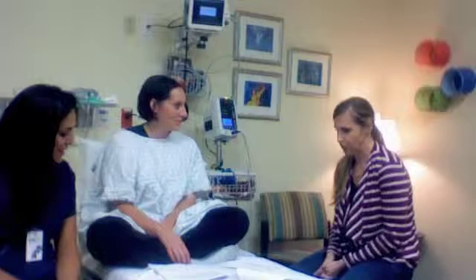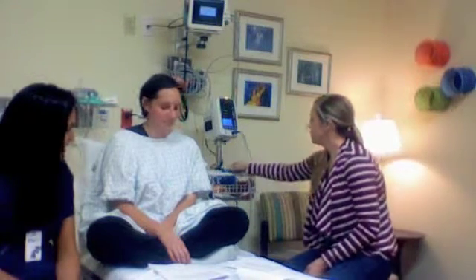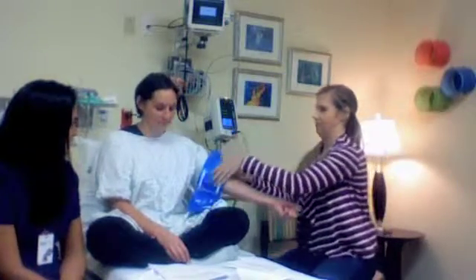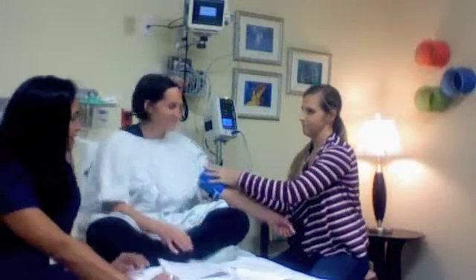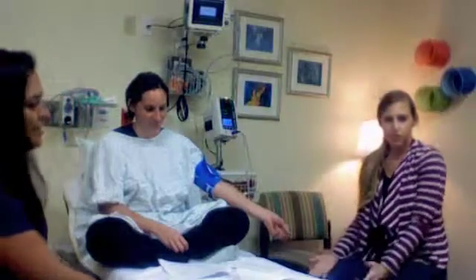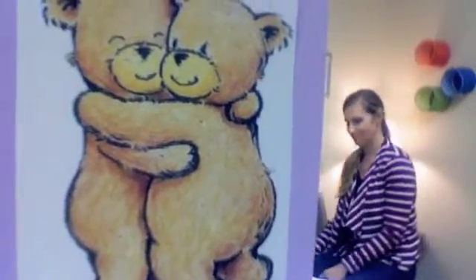Hi Jessie, I'm Sarah. I'm going to have to take your blood pressure today, and I'm going to need your arm, and this little device here is just going to give your arm a little hug. Which arm would you like to use? This one? Is this one okay? Yes. Okay. So when Jessie hears the word hug, she may think of this image instead of the other one. A much more peaceful image.